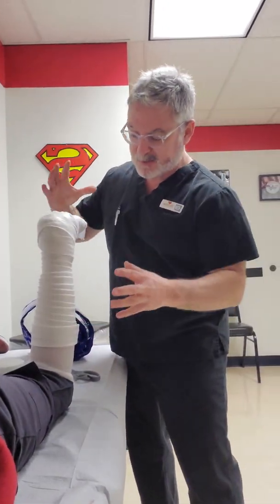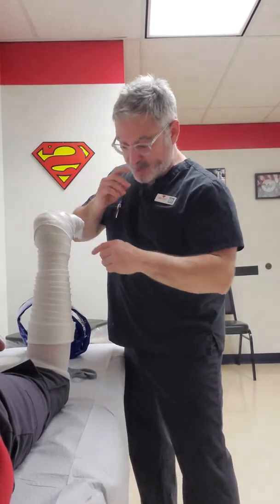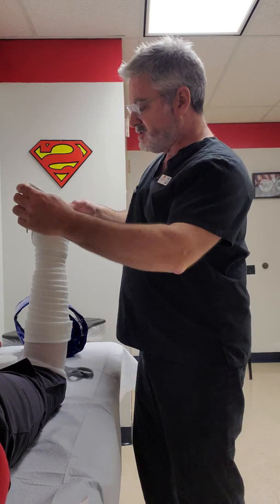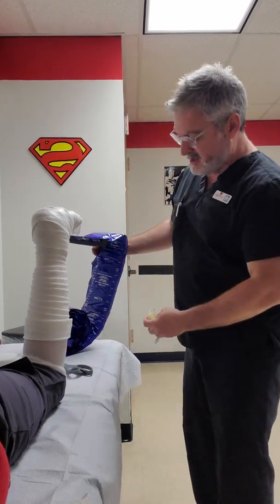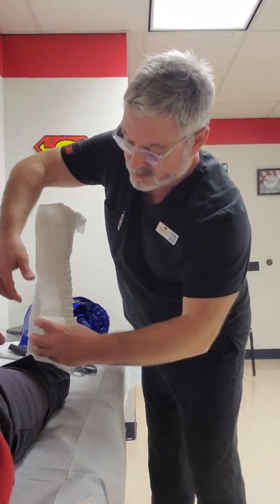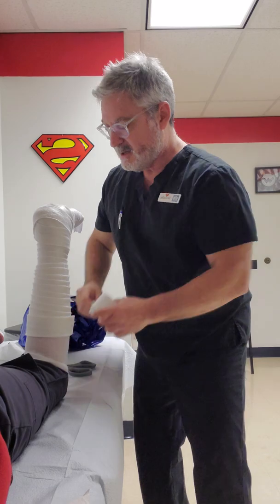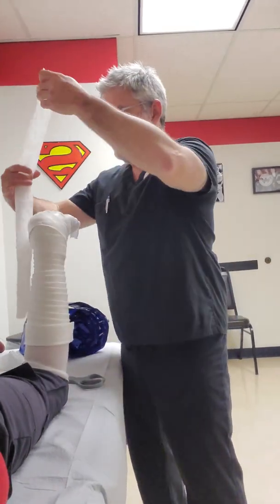I asked the young lady to pause it for a minute so you guys wouldn't get bored with me doing all the wrapping. What we're going to do now is measure for the posterior splint and for the stirrup. If you don't have a measuring tape — which we tend to keep in our drawers — a nice little trick is you get a strip of tape or a strip of cotton and just measure with the cotton. Pretty simple, and it saves you from having to leave the room.